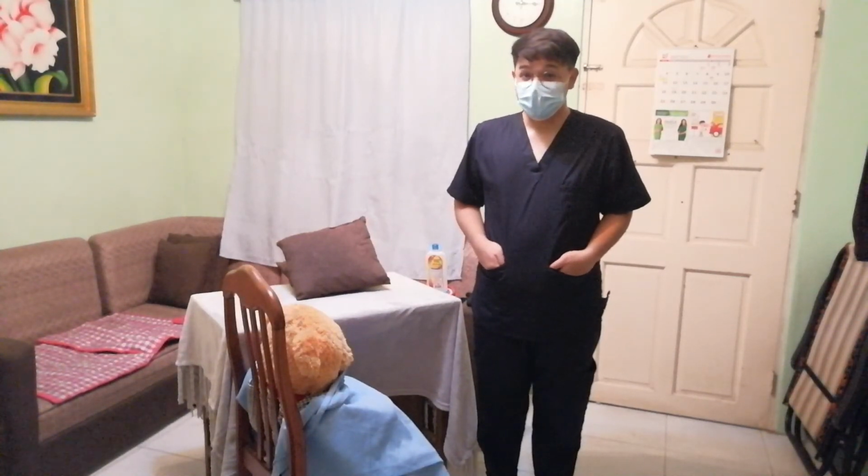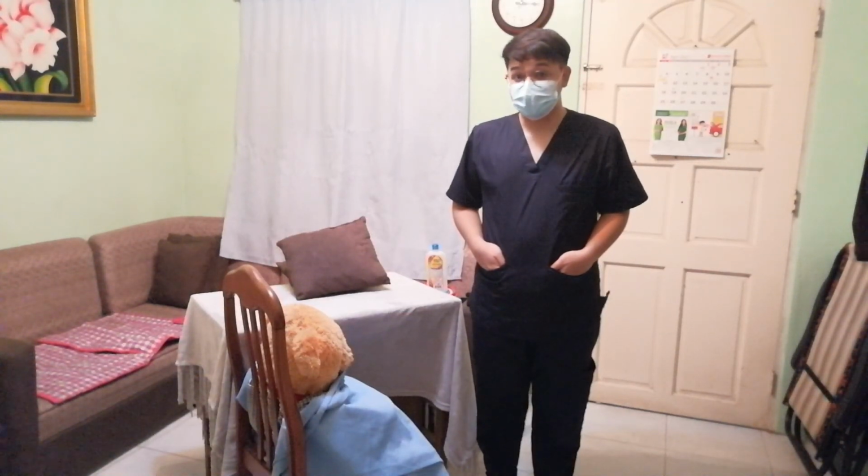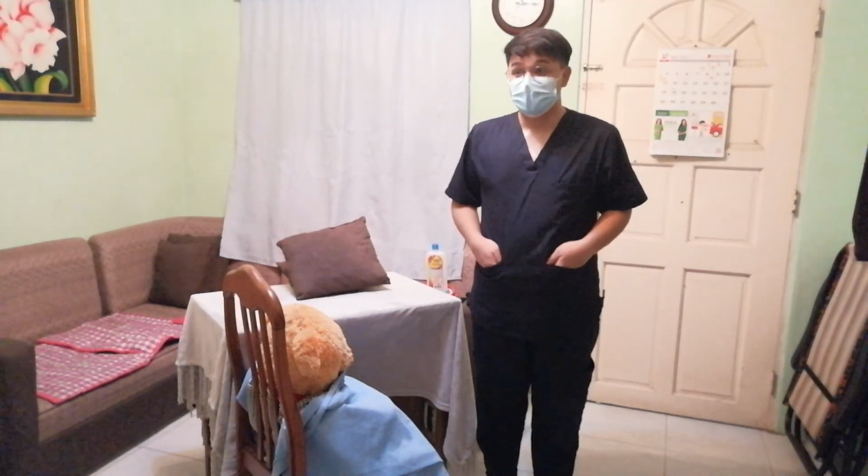And that would be all for the assessment of the transferring of the patient from the bed to the chair or the wheelchair.